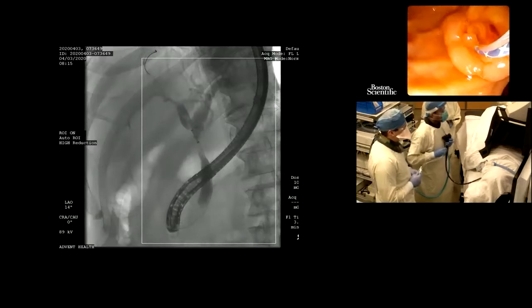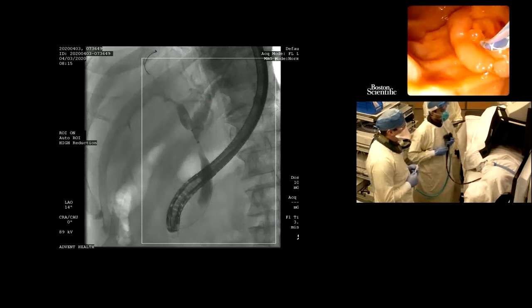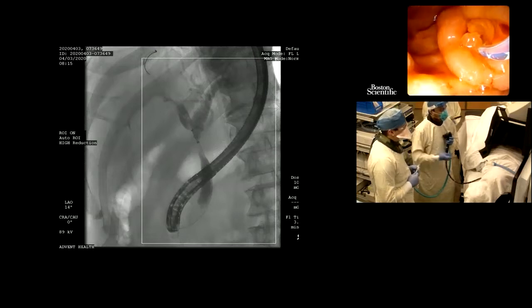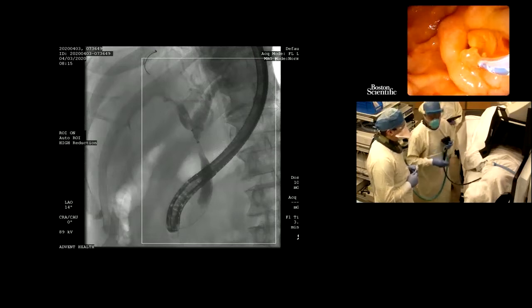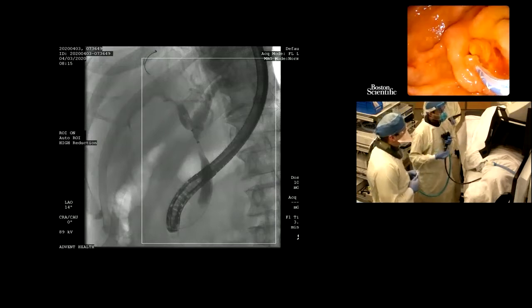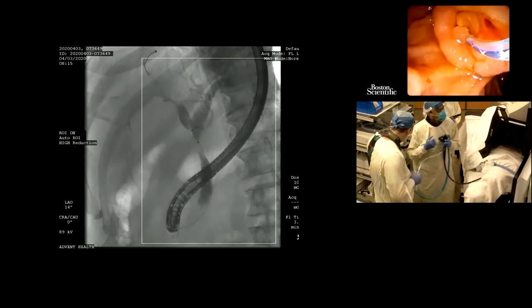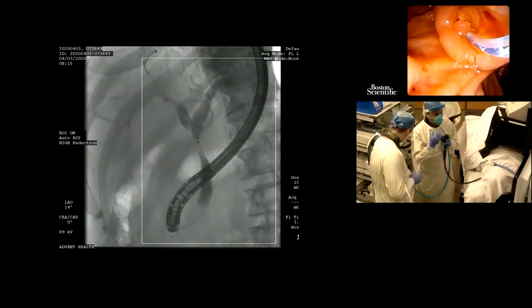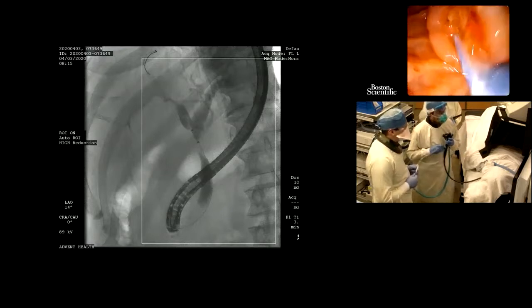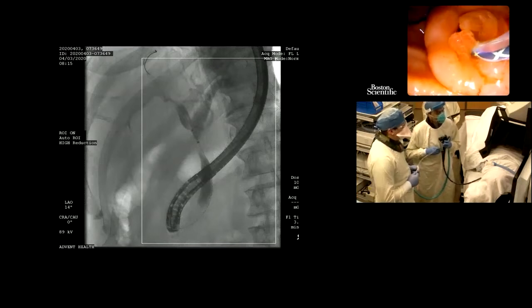Any questions from our audience? One just asking about if there was a need for white balance with the disposable duodenoscopes. I mean, no, white balance, not actually. You can see the quality of the imaging. At least when this question was asked, I realized that we are using the single-use scope. To me, it felt what it would normally feel with my imaging. Would you agree? I think the imaging quality is quite comparable to what we have with regular scopes.